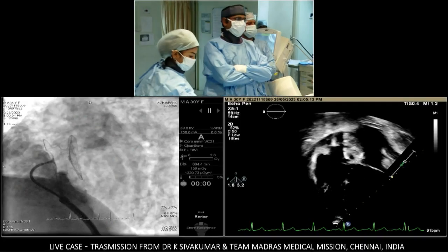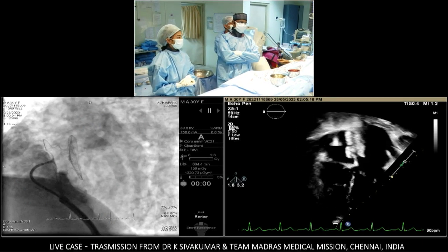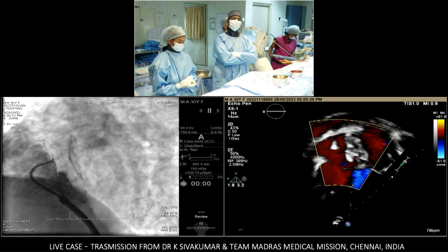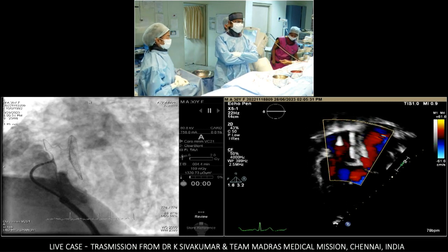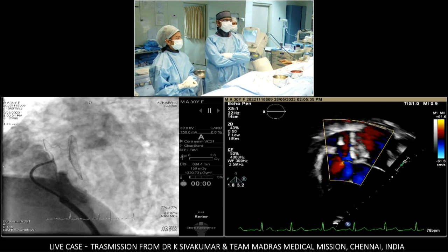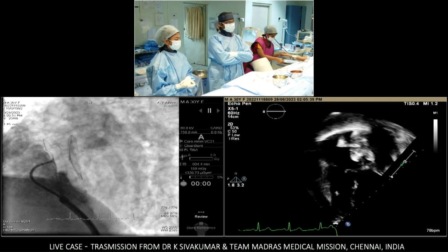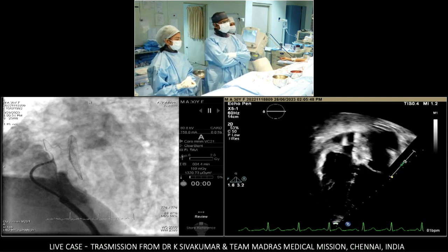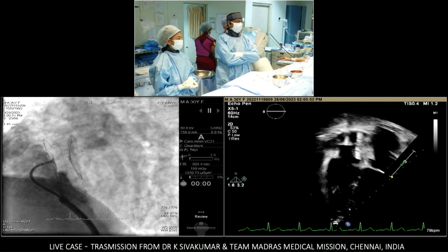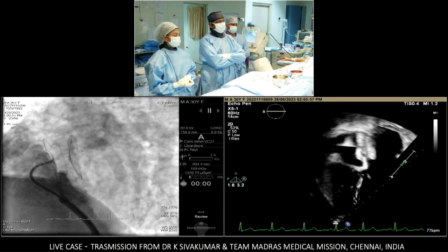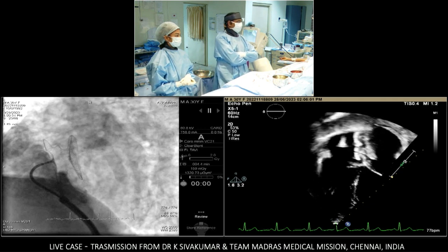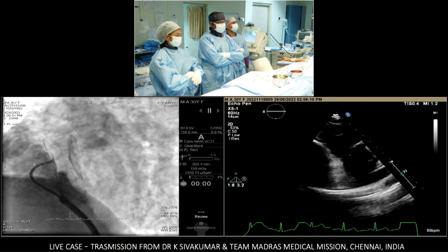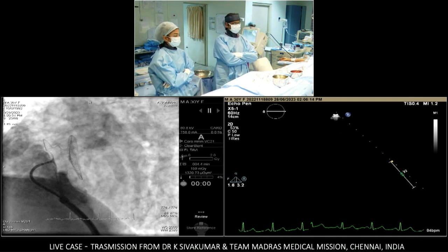Juan Granada asks whether there is too much tension in the attachment cable, and whether pushing the cable forward would compress the device and give a better idea of positioning. The response is that a Travisio cable is being used with no tension. Looking at the transthoracic echo images, the device doesn't look as bulky as anticipated — it looks fairly similar to a standard ASD device profile. The apical four-chamber view is shown, and a parasternal short axis will also be obtained.